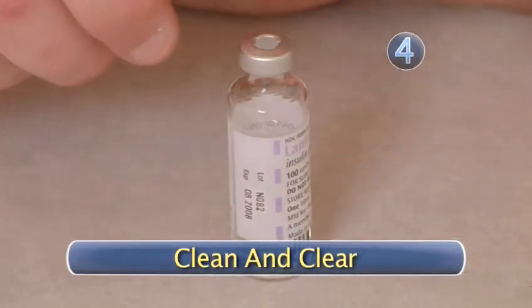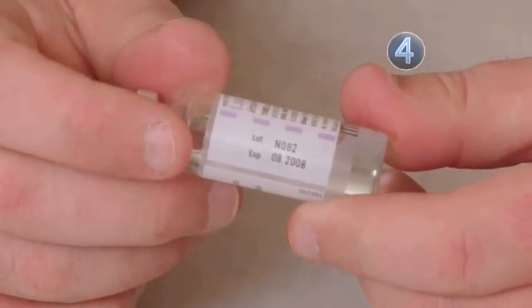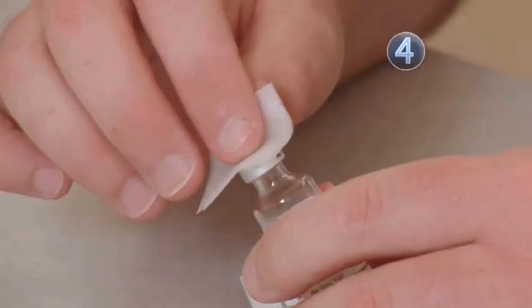Step 4: Clean and Clear. Clear insulin does not need to be agitated. To agitate cloudy insulin, turn the bottle on its side and roll it between the palms of your hands. Don't shake it. Now use the alcohol prep pad to clean the top of the bottle.